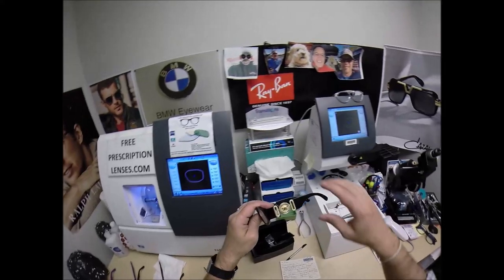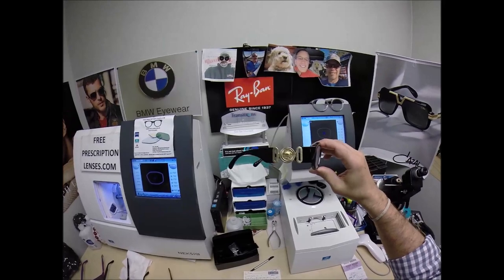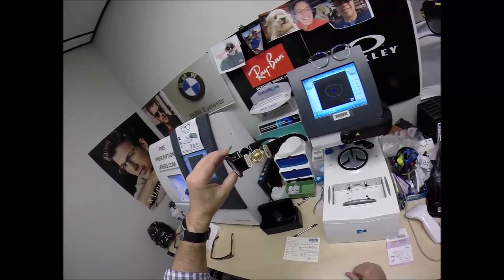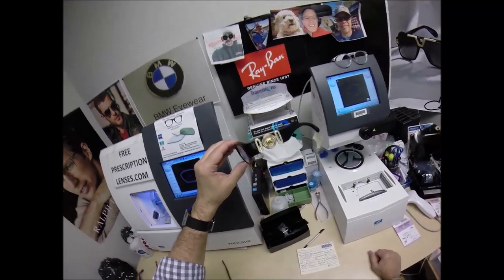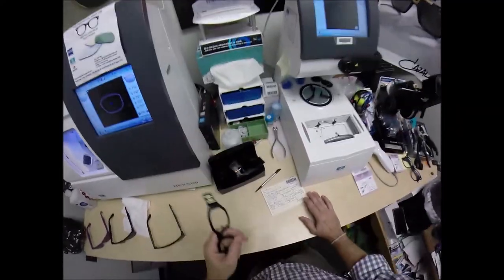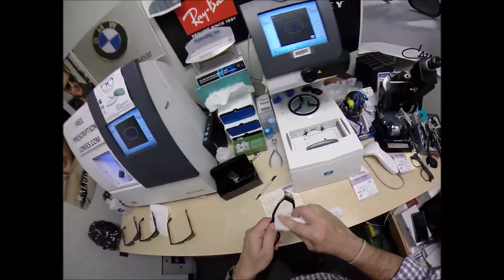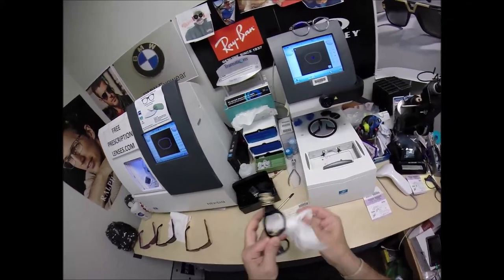Brian wants his Versace. This is the first of these I've cut — this frame is so nice. Part of that old school vintage collection. Now this is the portion of every video where, as I clean your lenses, I mention that there's free shipping anywhere in the US — and Lake Charles, Louisiana is still in the US.